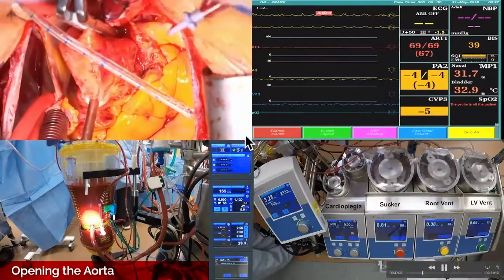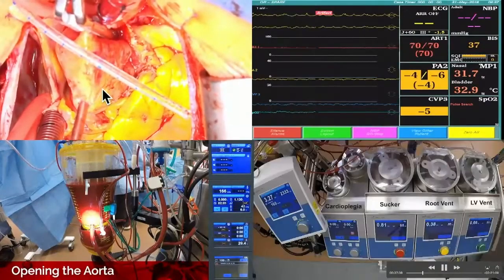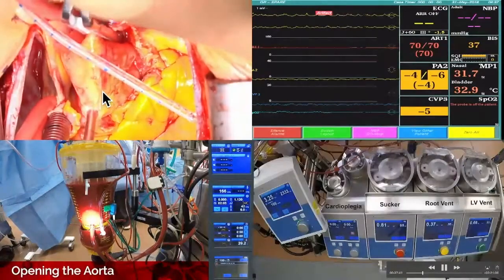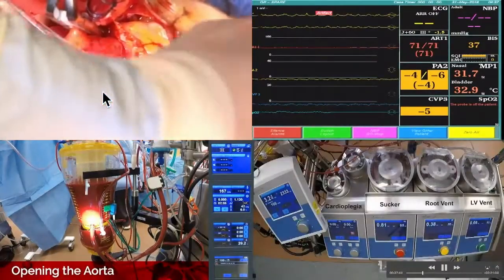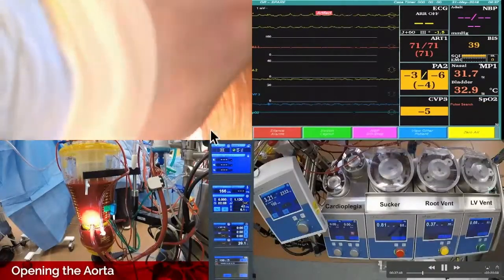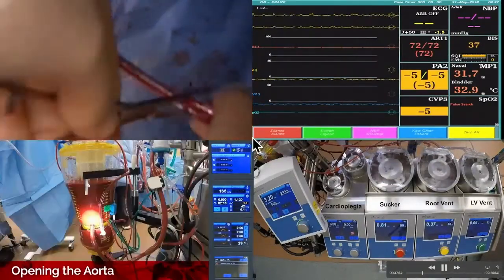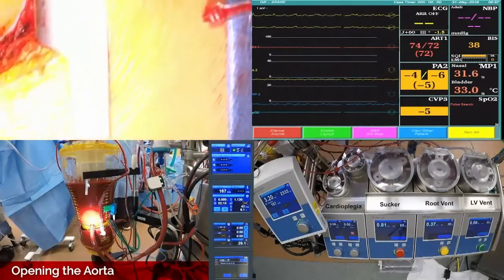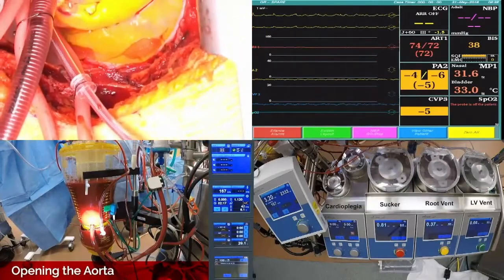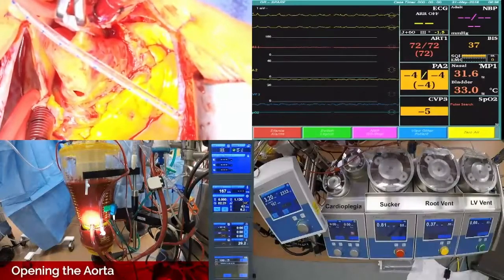And we imagine that all of these things, when you're putting stitches in and you're having to move them like when you do the valve, and I think we'll see it, they can get hung up on that stuff. I mean, there's enough stuff in there. I try to limit the number of, and this is Tony after she's put on the antegrade. She's super strong. I have to use a hemostat to get it off.